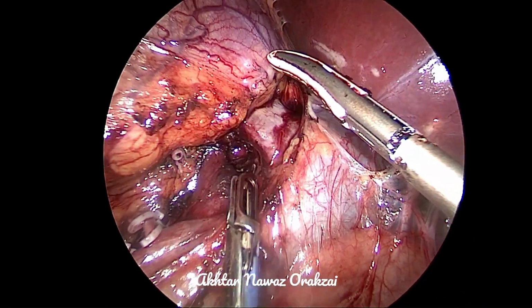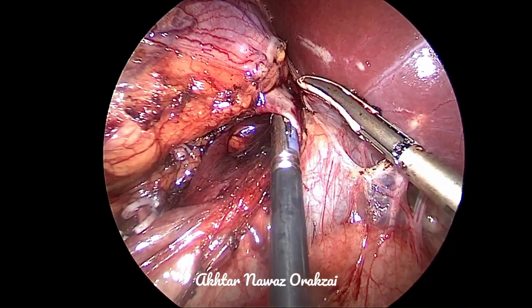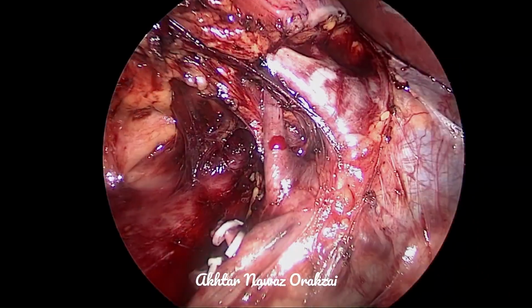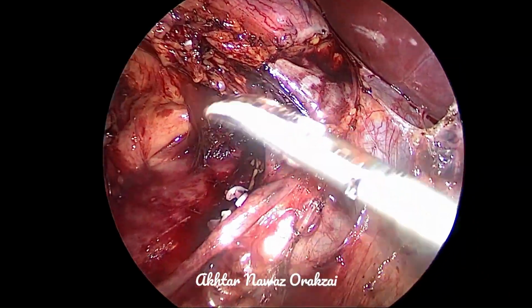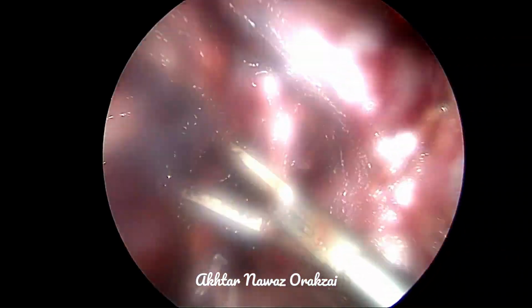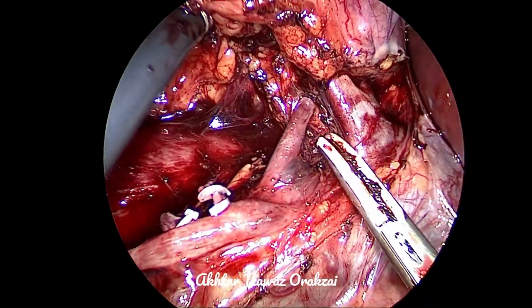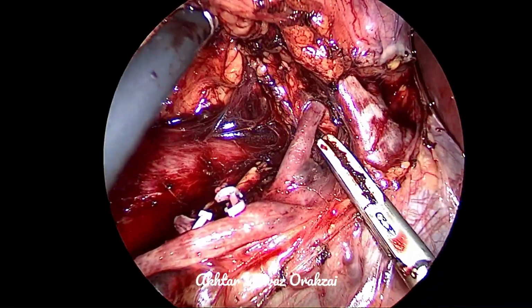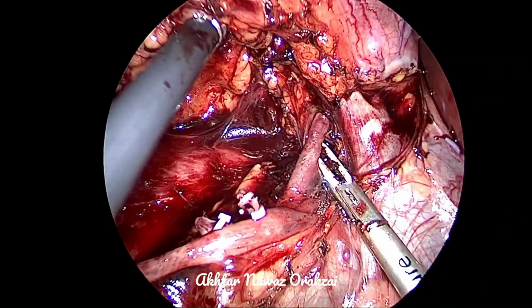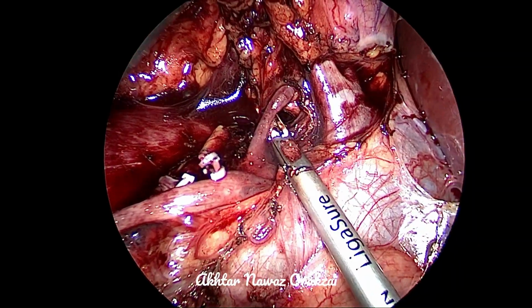Dissecting behind the vein so that if there is any artery, that will be isolated and easily dissected. But by the end, we came to the conclusion that we have to clip this vein, otherwise it won't be possible for us to clip this artery, and hence the progression of the procedure will be difficult.